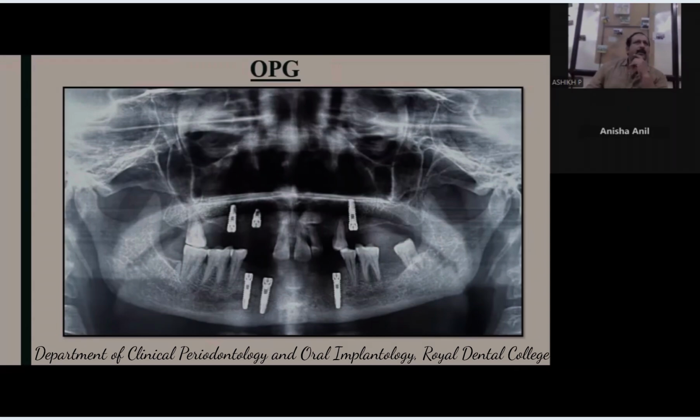So I think you have got sufficient space between the natural tooth and the implant. You can place it in a quite good amount of span area. Only the width of the ridge matters. Width we don't know. We need to know that by CBCT or directly while opening the ridge.